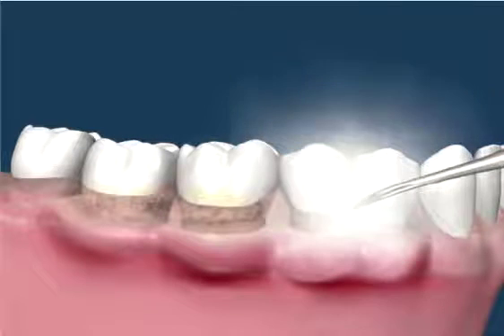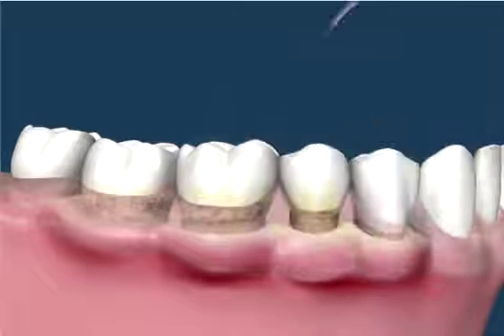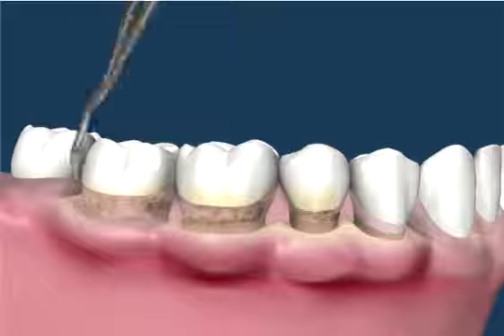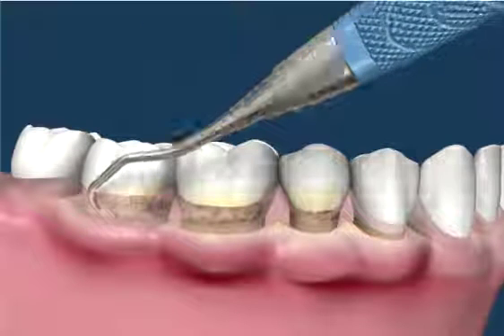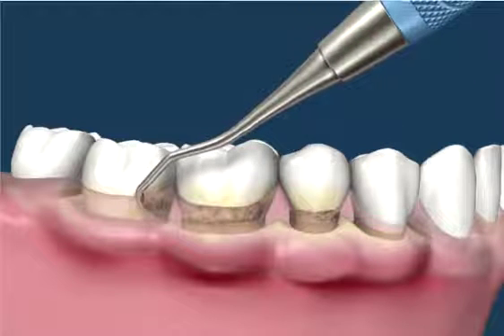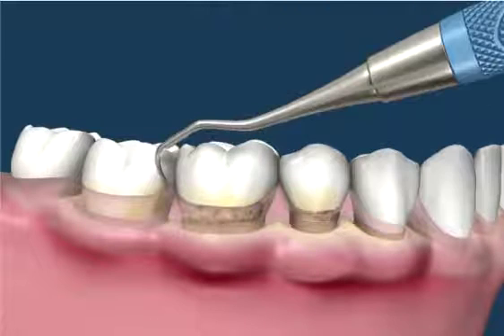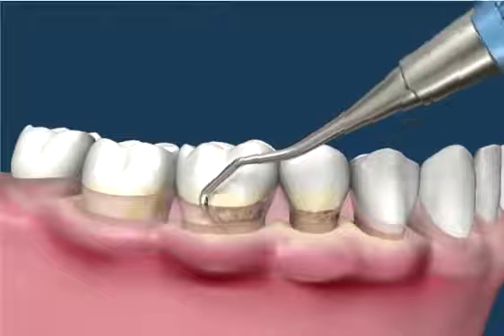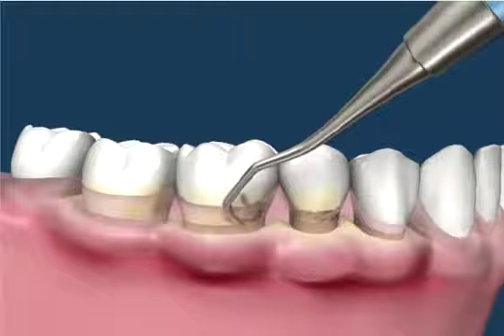The fine amounts remaining, especially under the gums, may require hand scaling instruments to remove them. There are many specialized scaling instruments that can be used to remove the calculus from all areas.